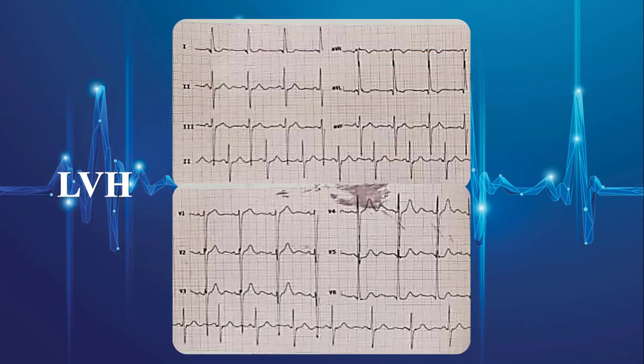The next EKG demonstrates LVH. As we expect, there are discordant ST depressions in lateral leads due to underlying left ventricular hypertrophy.